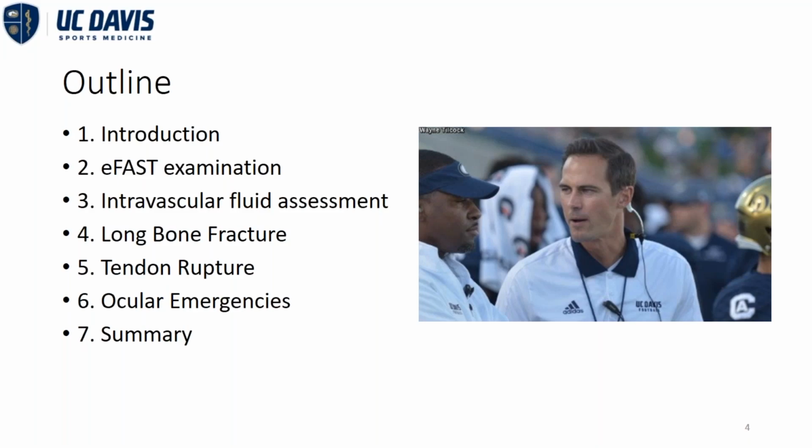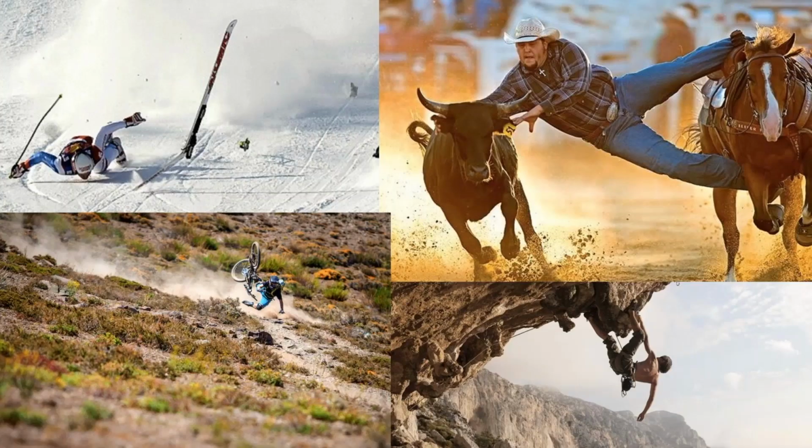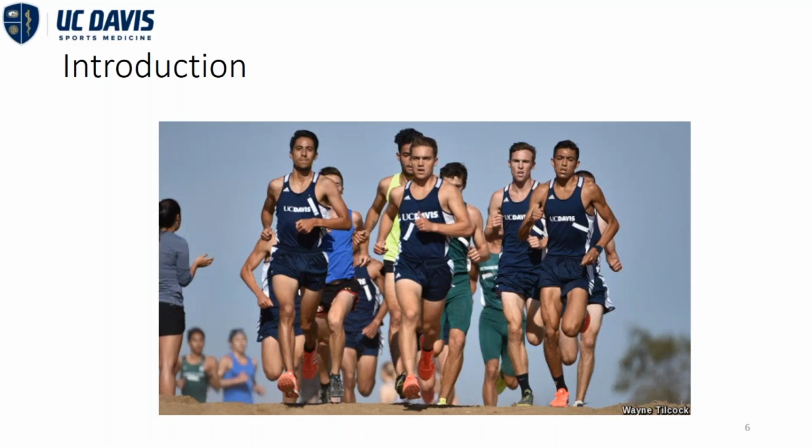We're going to go over a lot of information. And I think this information is going to be pretty exciting for you. So I derived the content of this talk from the times when I was covering events, and I really, really wanted to know an answer. So this is not going to be super useful right in the clinic setting, but if you're ever doing event coverage, sideline coverage, or if you ever have athletes coming into clinic from events and sidelines, I think this is going to be right in your wheelhouse.